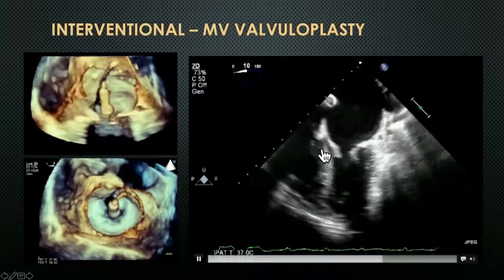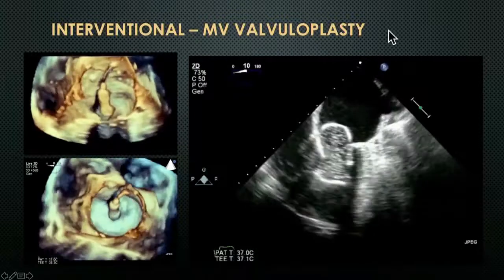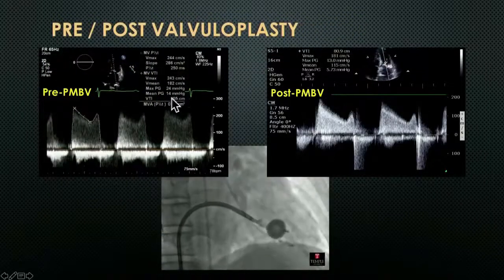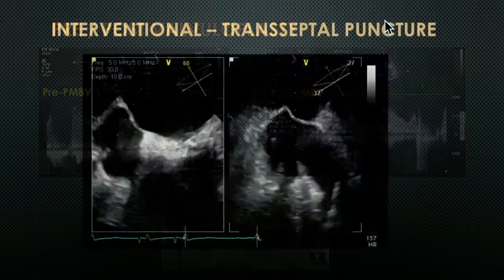Both 3D and 2D imaging can be used for mitral valvuloplasty. And obviously, there's been improvement here after the balloon inflation with a reduction in gradient.